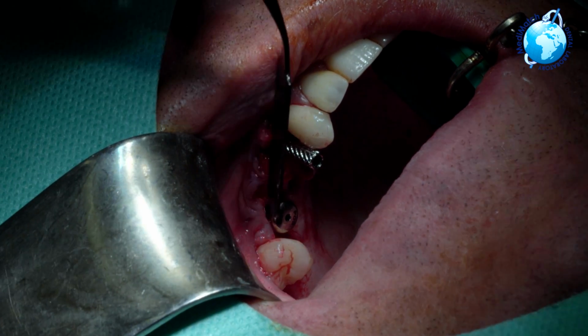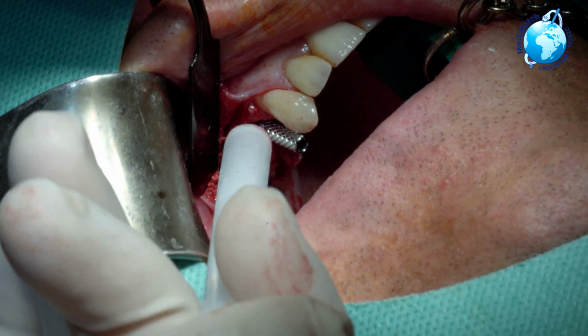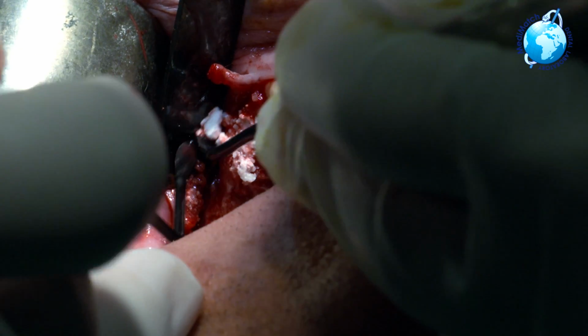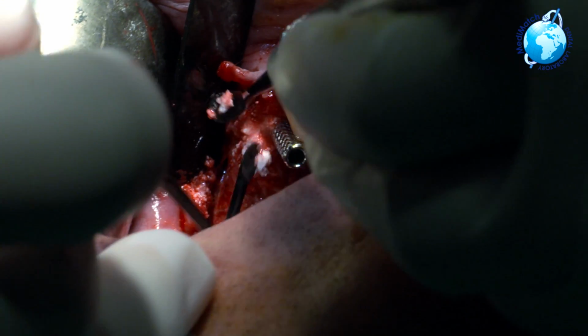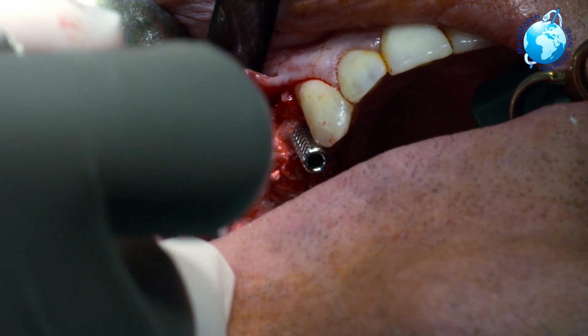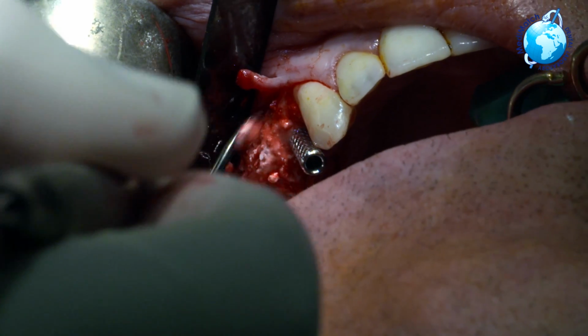Followed by a little bit more Ethos, which is the grafting material. Okay, I'm trying to get this totally in view. So this material I want to put in, can you grab that and put it into the socket please? Around there. So you can see this is filling the buccal gap, otherwise known as the jump gap. Job's a good one. Keep that bone there.